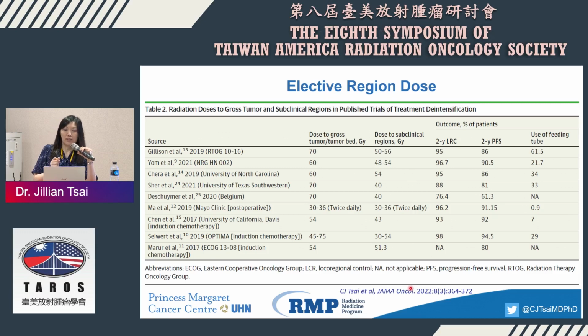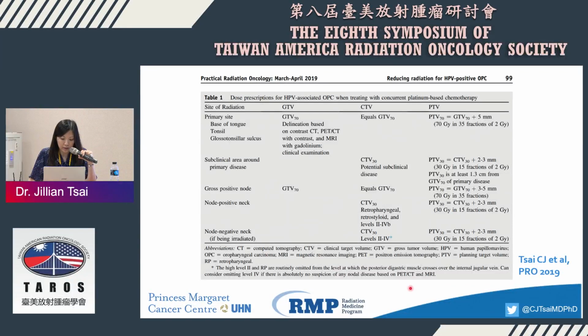If we look at the history, this dose was determined in the 2D era where you couldn't really see the tumor. So you put in a large margin and large dose gradient to cover all the possible regions. There was fluoro simulation, so there's no CT sim, no PET CT sim, so you don't really know other gross disease, so you cover them with a very large margin. So this is just highlighting the huge difference.